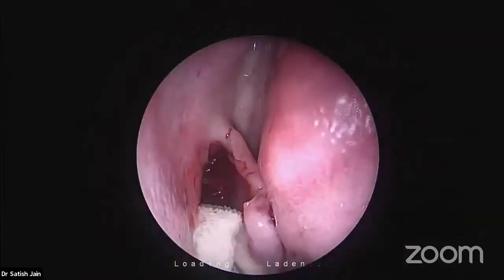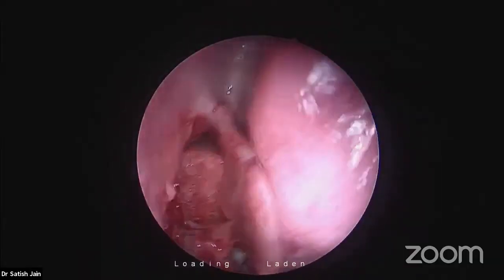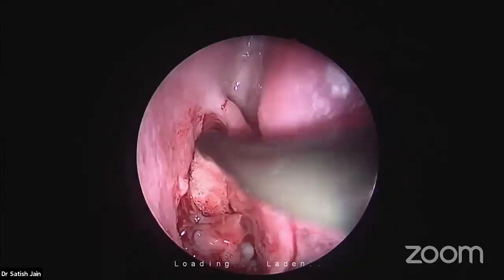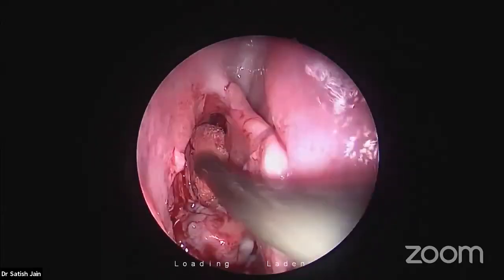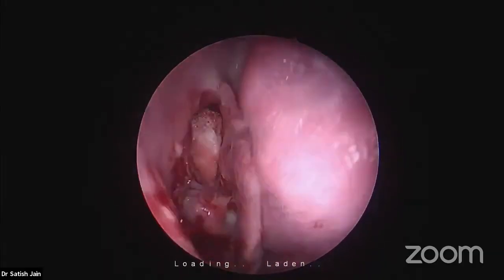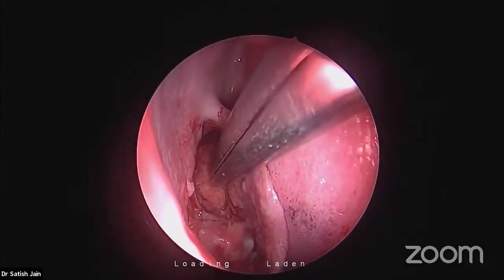Sir, fovea means impression. Yes, sir. What about hiatus semilunaris superioris? Could you put in a word about that? Hiatus semilunaris superioris. Yes, sir. Let me show you. I showed you between the bulla and the uncinate process, that was hiatus semilunaris inferioris.